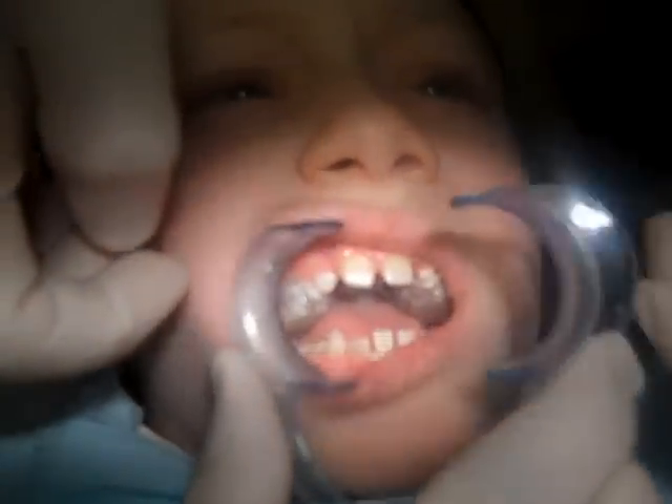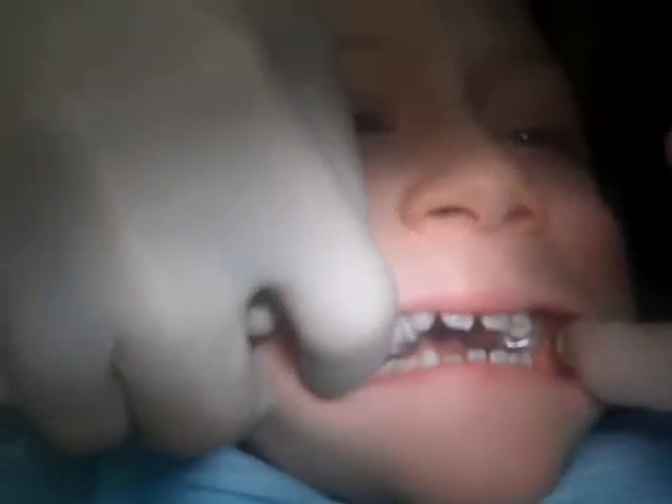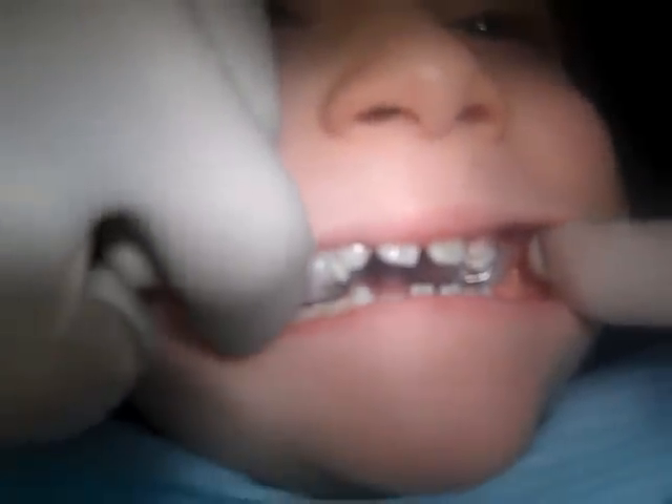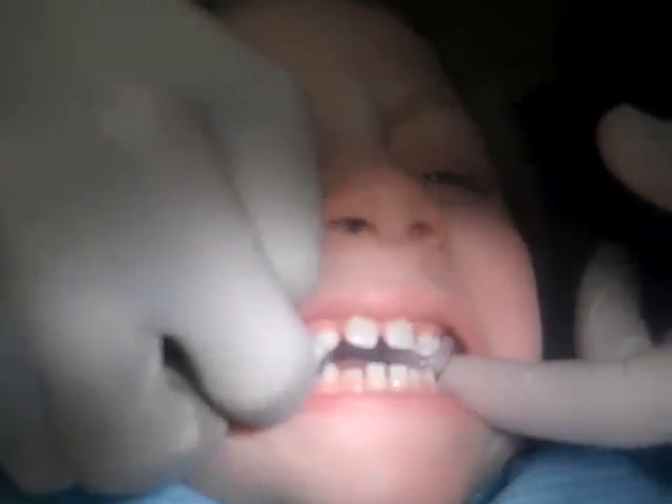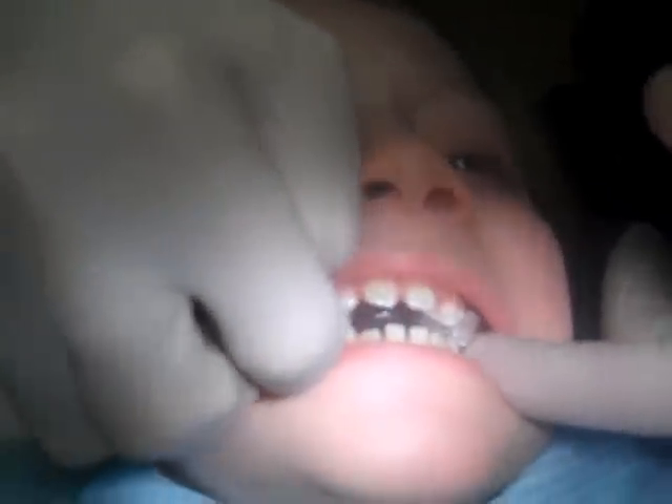Logan is just being unbelievable here. We just press it on the teeth. Logan, you're doing a great job. Logan, you're going to bite down for me hard now — hard. You can bite harder than that. Open big — good job. That's it. Good job. Now we're just going to clean the glue off.